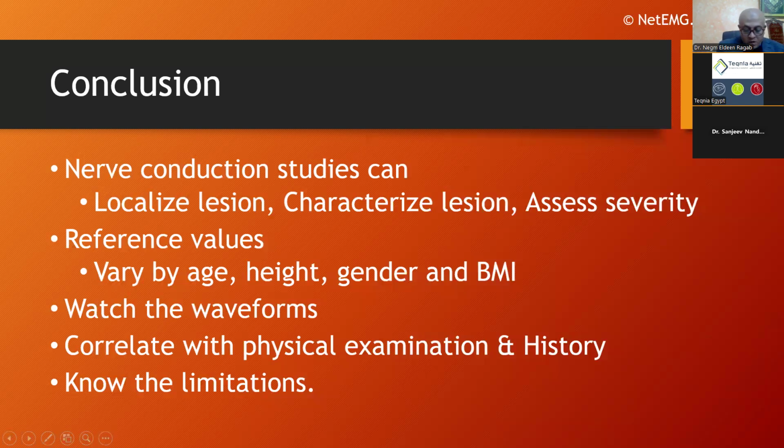Right. Okay. I think my last question is: Professor Kimura mentioned the value of the F wave velocity. If we calculate the velocity using the distal and the proximal stimulation, and then get the proximal conduction velocity, what about the impact of this for each pathology?